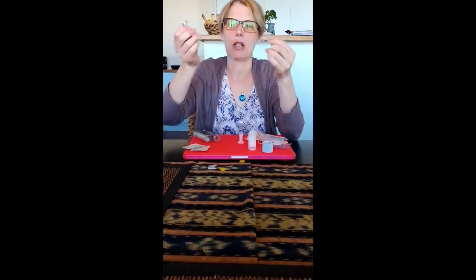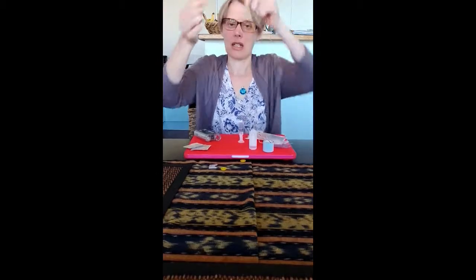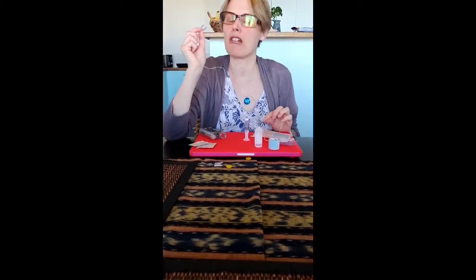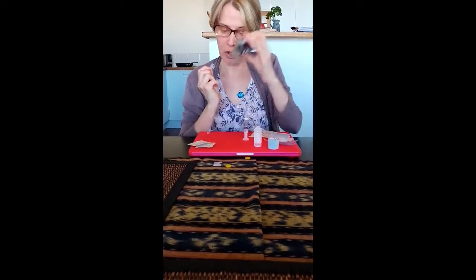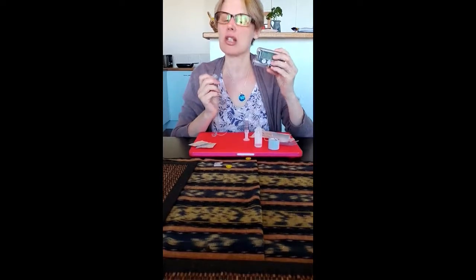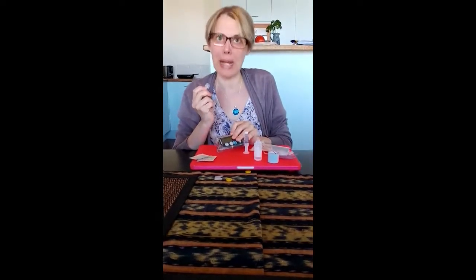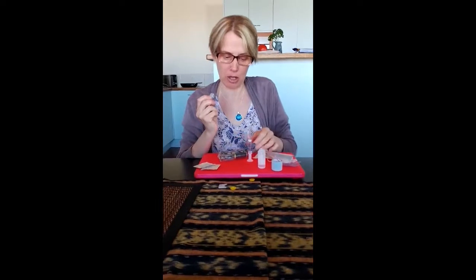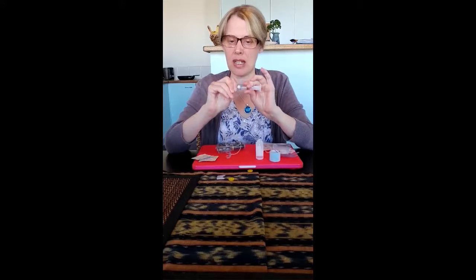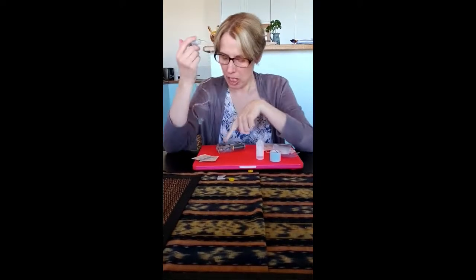I take the tubing out. The tubing has a connector at one end, and these are universal for all the Paradigm sets — so if you're using a Paradigm pump they fit all insertion sets, and I think there are about six different types. The Mio is the most popular one worldwide right now. You just pop it in and twist until it clicks. There are two ways to load it: from the pump, or by hand.